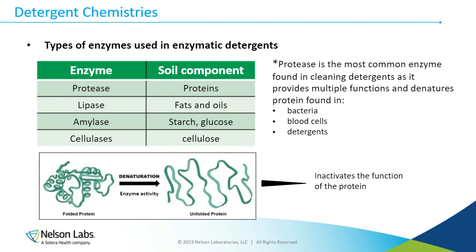And some of these enzymes can cause problems or can be sticky to your devices, which can cause problems with the analytes or cytotoxicity testing as well. So you want to make sure that these enzymes are okay to use as well.